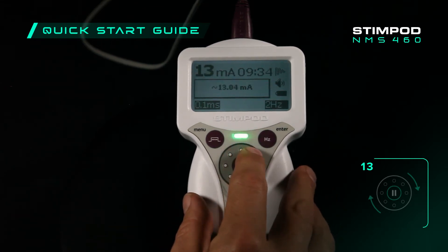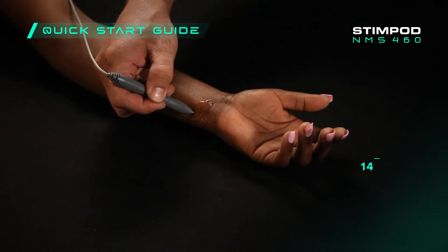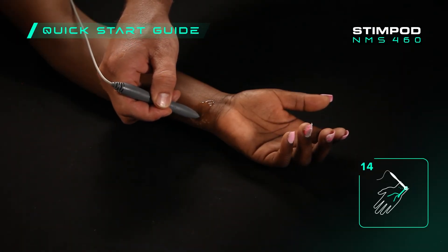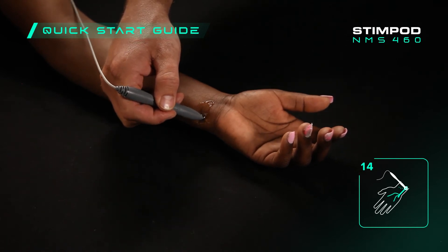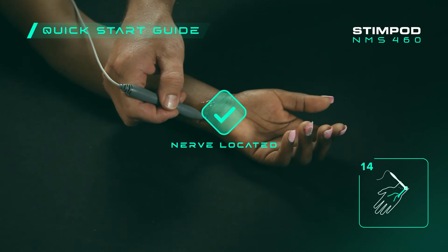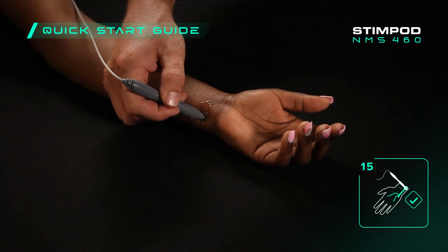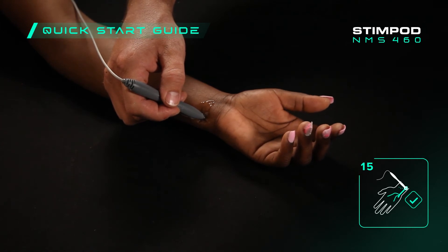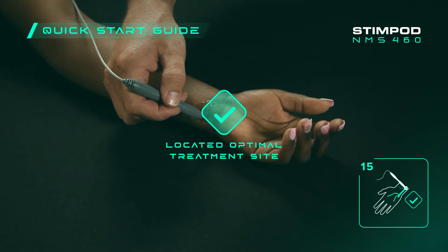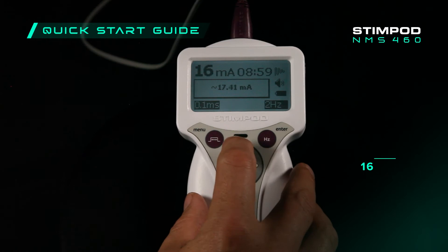Use the StimPod's adjustment wheel to increase the current to a level that is still comfortable for the patient. Start to move the treatment probe around within the treatment area until the appropriate fasciculation is observed or the patient can feel the current radiate through the nerve. This will confirm that you have located the nerve. You may now continue to trace the treatment probe along the nerve until the maximum fasciculation is observed or the strongest nerve sensation is experienced.